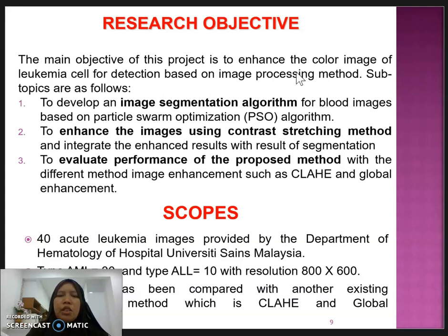Now we move to the HSI color image saturation. This is why we need to enhance the color image, because we want it for detection in the image processing method. The subtopics we are going to cover in this study are, first, to develop an image segmentation algorithm based on the PSO algorithm.